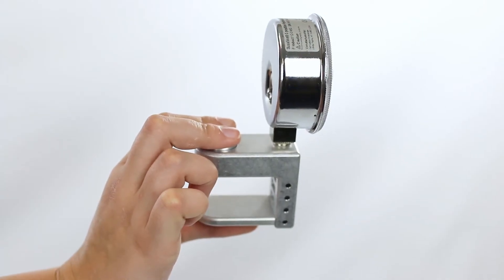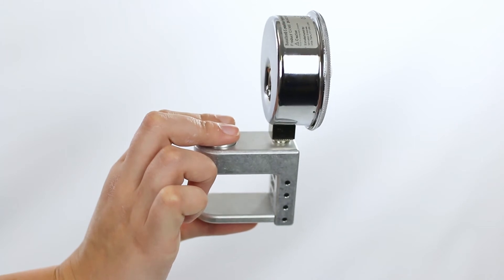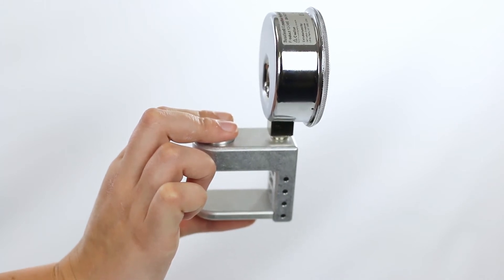For the palmer test, the patient's palm should be facing down. Have the patient pinch the gauge between the thumb and index and middle fingers.